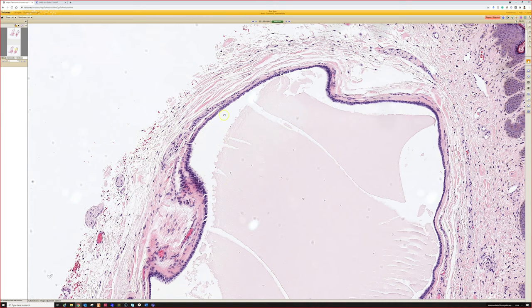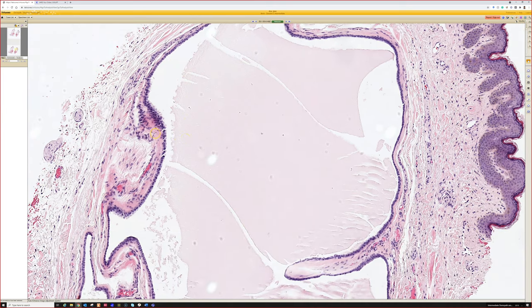And if you see papillary formations pushing into the lumen, another thing you can think of is cystadenoma, which I think of as a Hidrocystoma with a thickened, more complex lining. But one other thing to remember is near the eyelid, something that looks like Hidrocystoma with proliferation sticking into the lumen, you always have to think of endocrine mucin-producing sweat gland carcinoma.